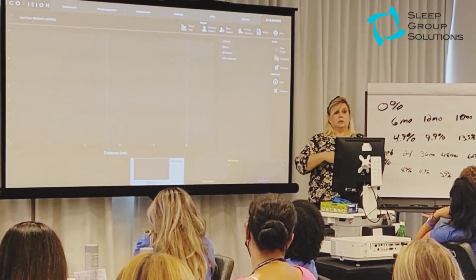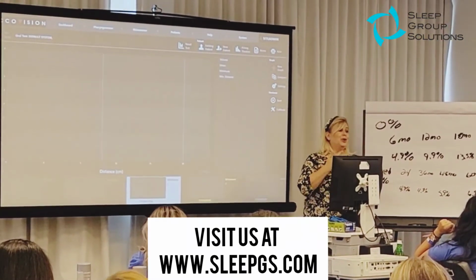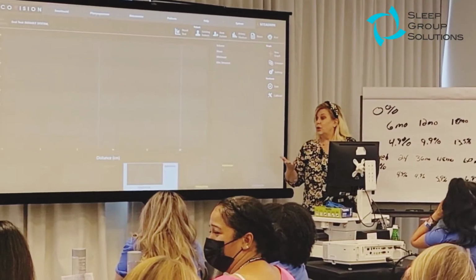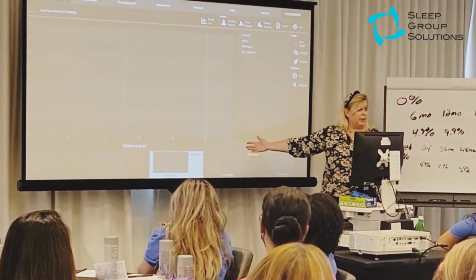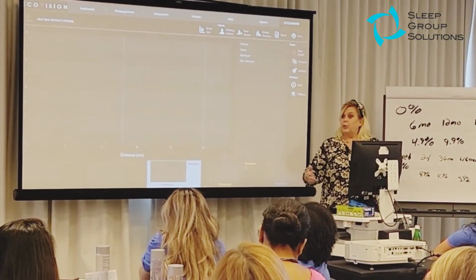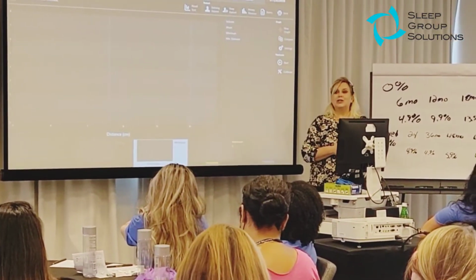And the patient says, "I've had Juvederm, you ain't putting a CPAP on my face. So I want an oral appliance." So great, we have a patient now that is positive for sleep apnea with a collapsible airway, but doesn't want a CPAP. So they prefer the oral device that we make in our office. So where do I start?